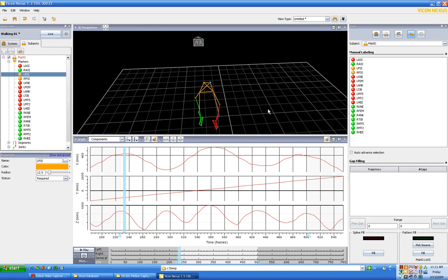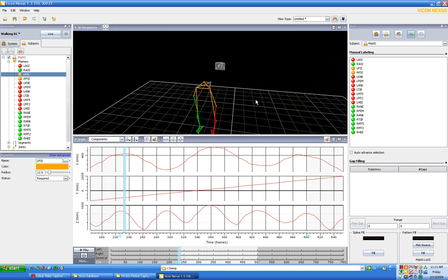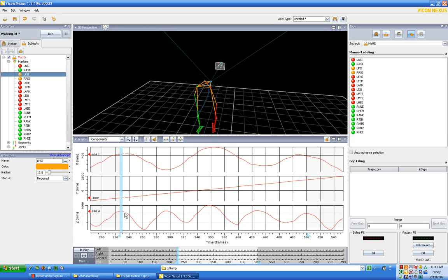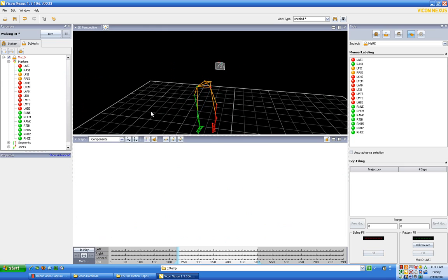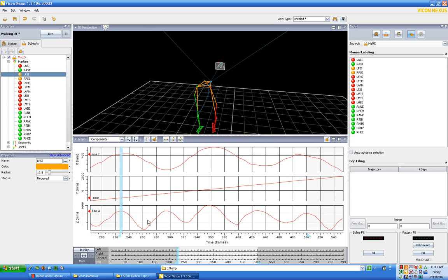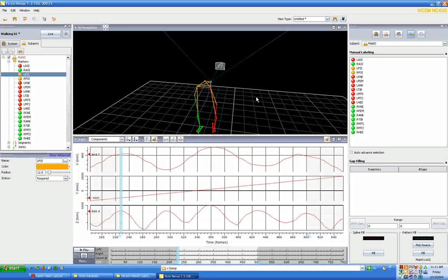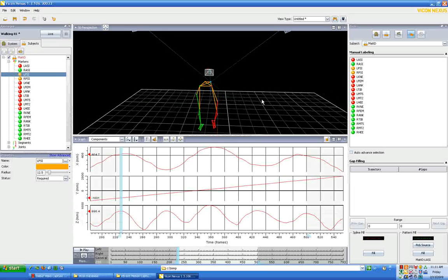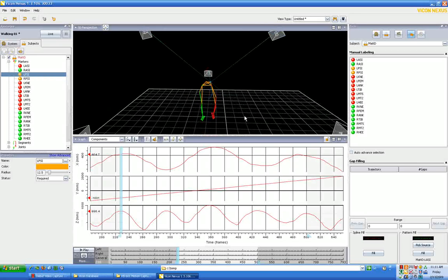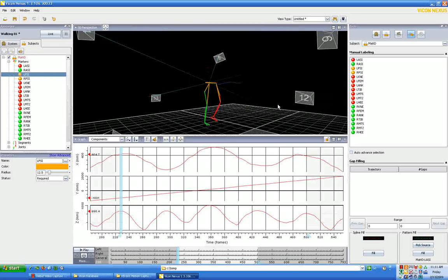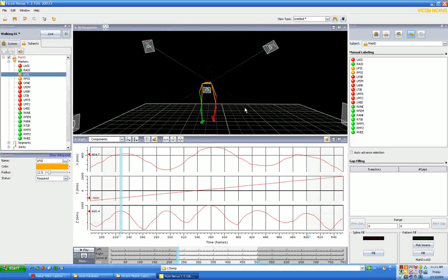And now we no longer have a gap, but it does still look like the gap is here. What we need to do is click in the black area and then click on the dot again, and you'll notice our gap is now gone.